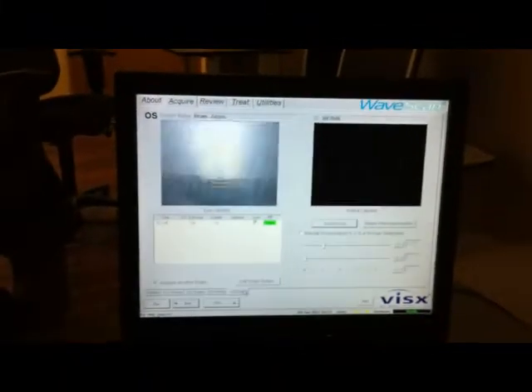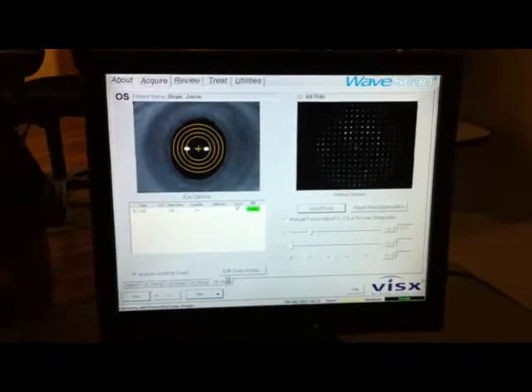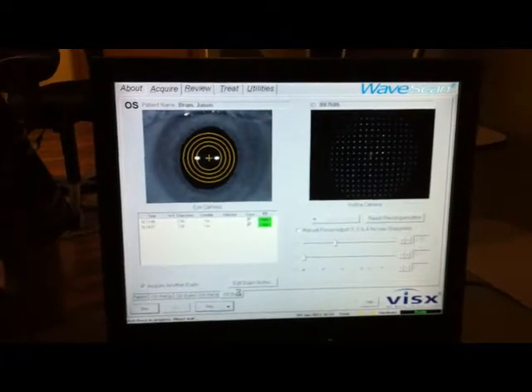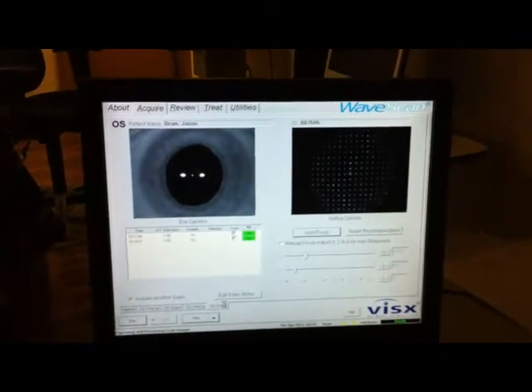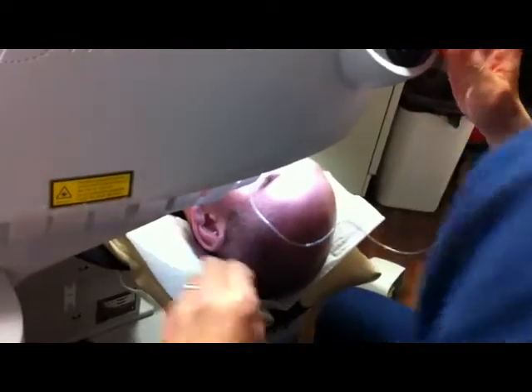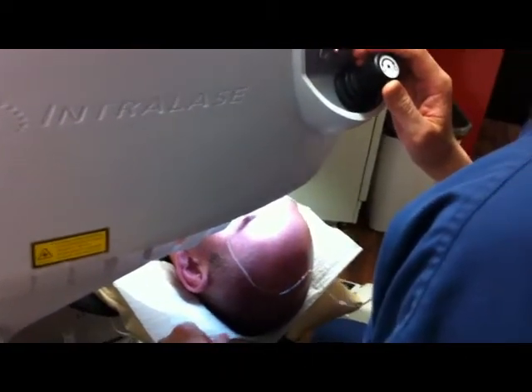Good. Blink twice. Open wide. One, two, three. Good. Beautiful. Blink a little bit. Perfect. Blink once. Open wide. One, two, three. Perfect. It actually went up to 3.8. Is it stable? It's stable now. Beautiful. You doing okay there, Jason? Yes, sir. All right, we'll be done in the next 30 seconds. Steady hand.